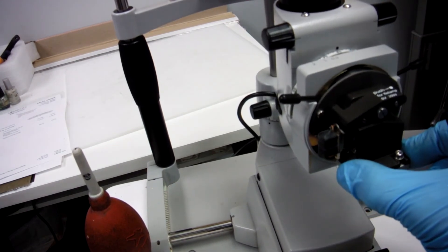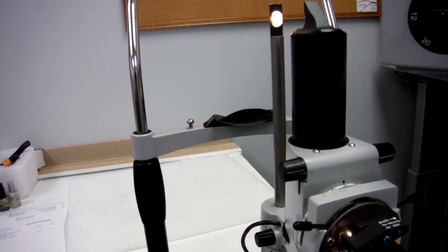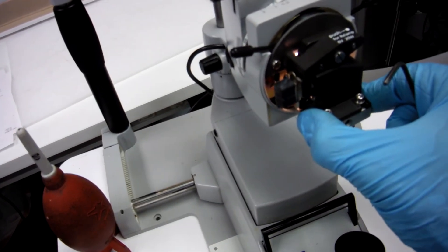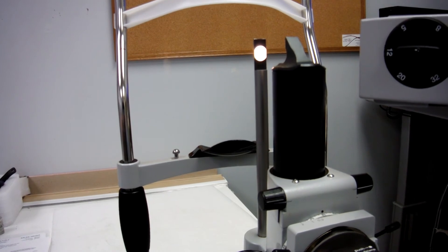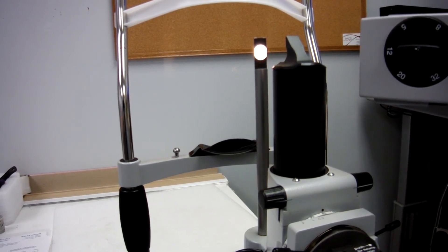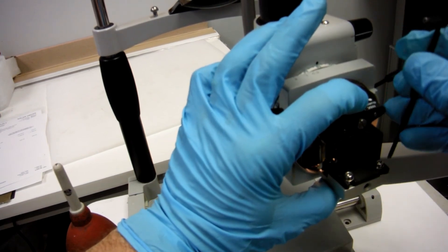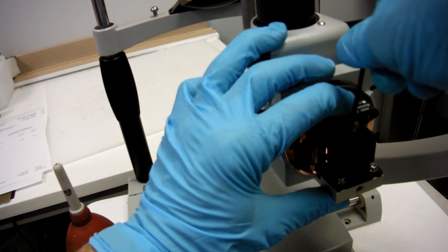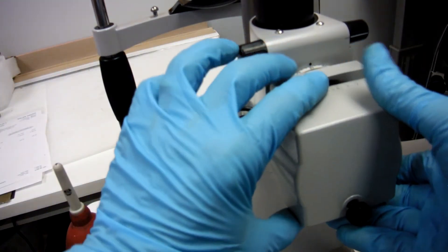Turn on your power and observe your focus rod light. Get the brightest, cleanest light. While holding your light assembly, you can move it with your hand — look at your focus rod. When you like the brightest, cleanest light, hold your light assembly, tighten it down, and put your cover back on.